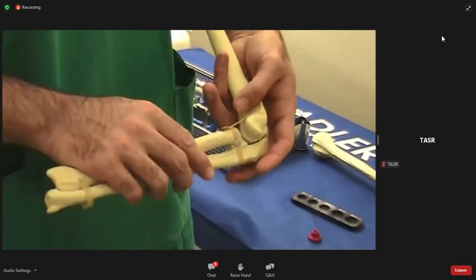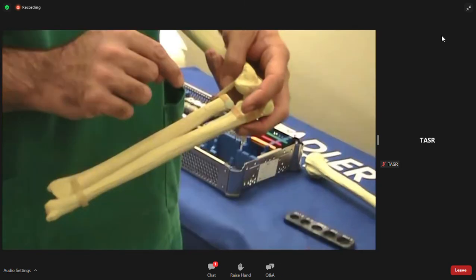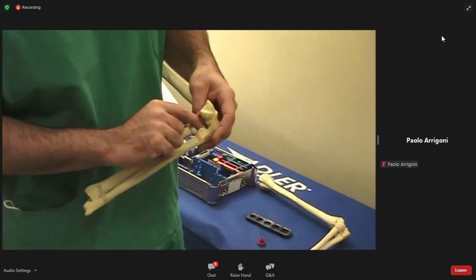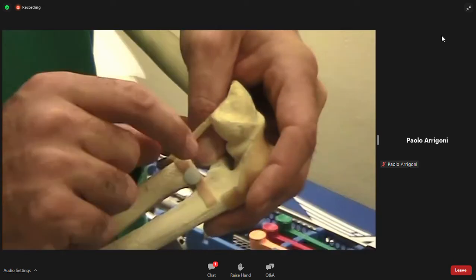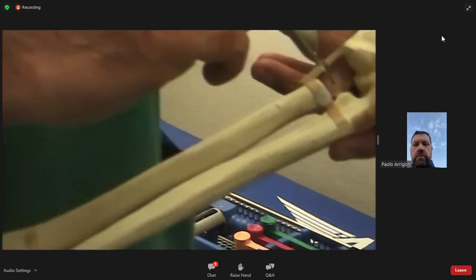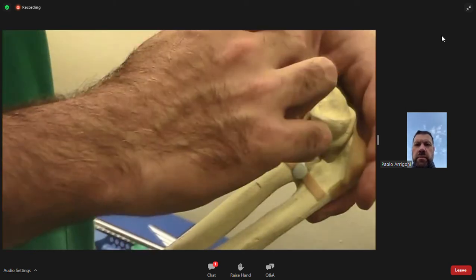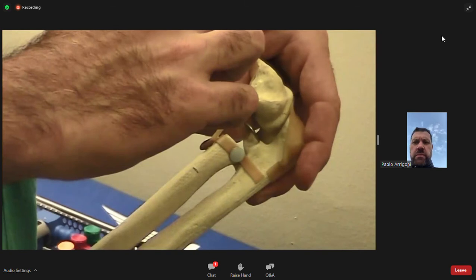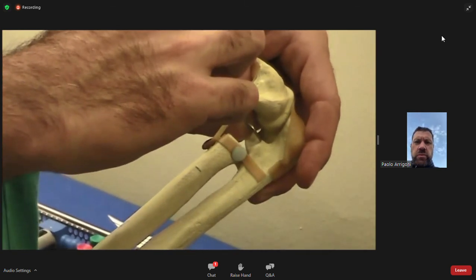First of all, don't take any reference from the humerus. Just take the reference with the sigmoid notch, with the highest profile of the medial side of the proximal sigmoid notch. I'm going to use this fork to indicate what is going to arrive at this level, to fill this gap, completely independently from the height and from the contact with the humerus. And this gives you a reference.